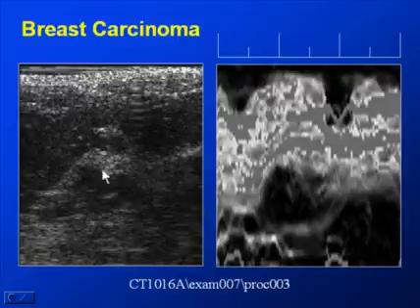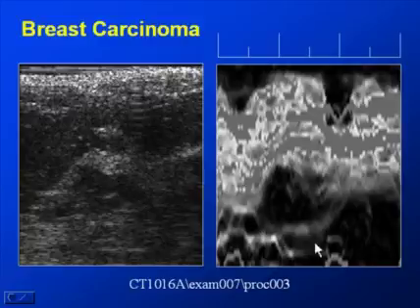Likewise, here you see a small breast carcinoma, and you see the equivalent elastogram here. One of the important things to consider is the fact that the elastogram looks much bigger. The lesion looks much bigger than it looks in the ultrasound sonogram. And we think that has to do with the desmoplastic reactions with the cancer and the surrounding tissues, which infiltrate the tissues and make them stiffer than they would otherwise be, but we're just not able to depict things like that in regular ultrasound imaging.